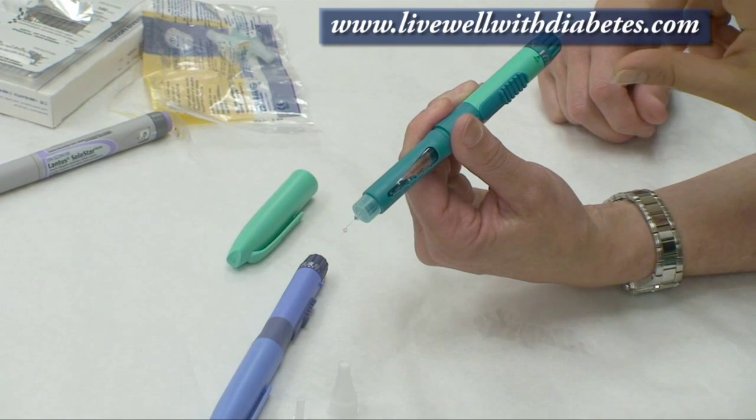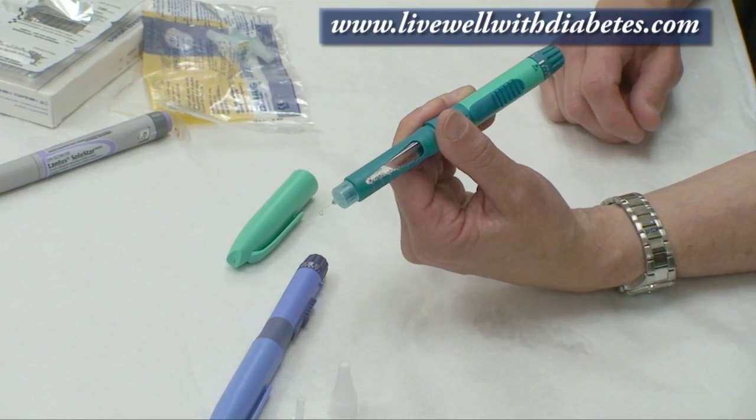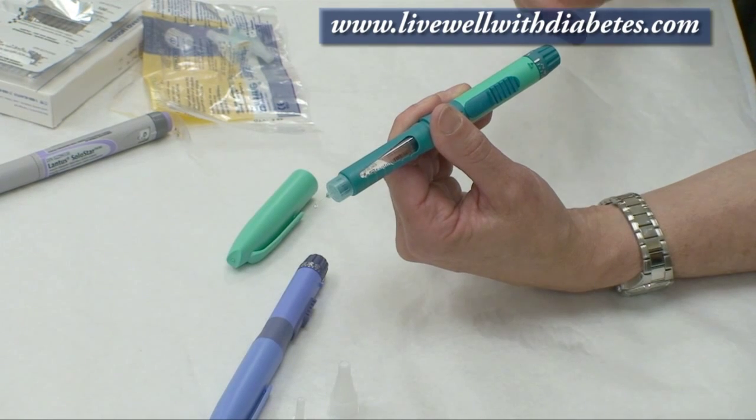Can you go backwards with this pen? No — if you make a mistake with your dialing of the dose up, you have to waste that dose and restart.